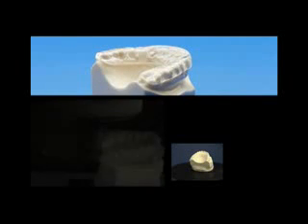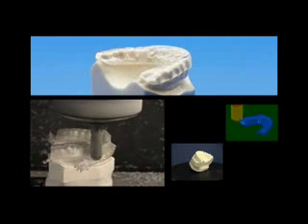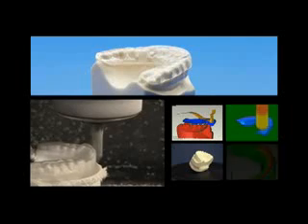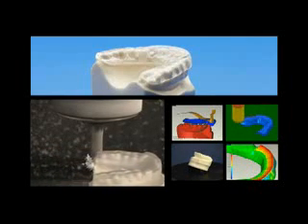With almost 1,000 cases performed during beta testing, the reliability and performance of this technology has been demonstrated. Occlusal splints with flat, accurate, and reproducible surfaces can now be routinely produced.